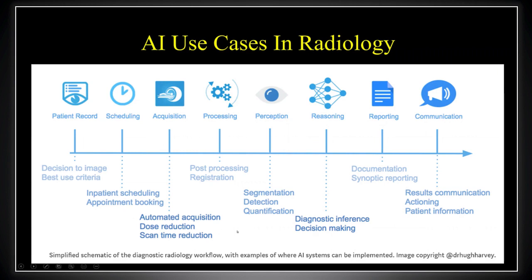We'll talk a bit about image reconstruction during the course of our presentation, but as you probably know, AI is really, really good at segmentation as well as detection and quantification. And it is already raising human capabilities beyond where they would go on their own. In other words, the combination of man and machine is greater than man alone. It can also be used for reporting, giving summaries of reports, or even potentially doing reports at different grade levels or for different physicians. And of course, it can also do things like optimize billing, ensure that follow-up recommendations follow established guidelines and the like.